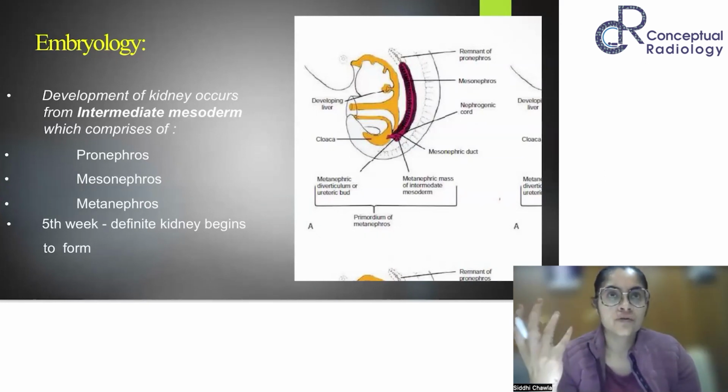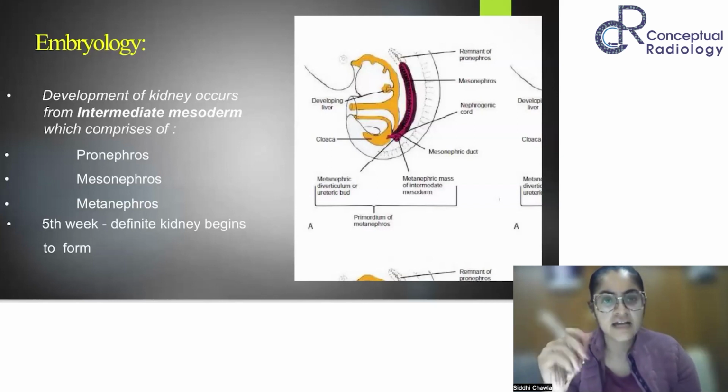Right. So today I was given the opportunity to present the imaging in pediatric renal masses, but I thought that I'll first cover the congenital renal lesions. And it is just the spectrum of this, that the last part is the pediatric renal masses, which will be covered in the next session.